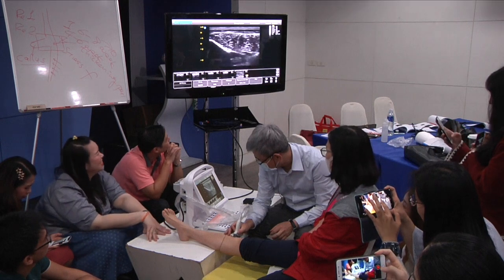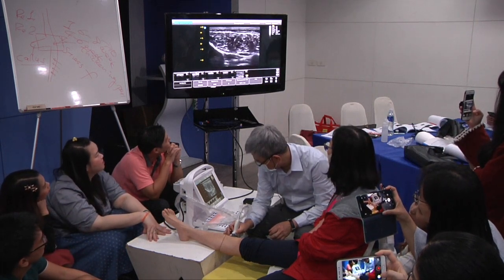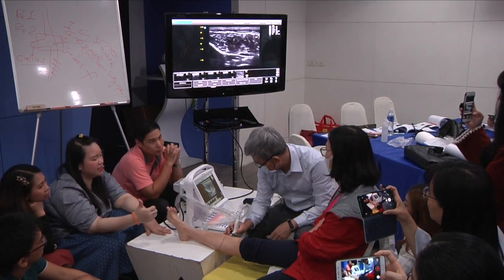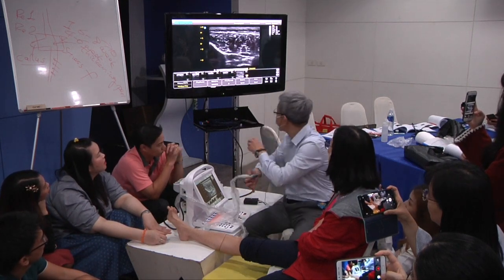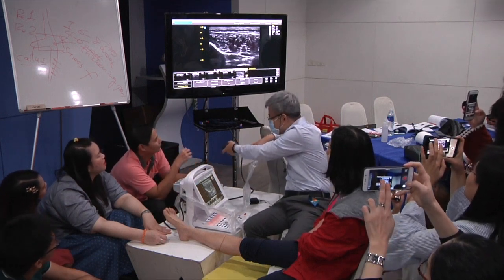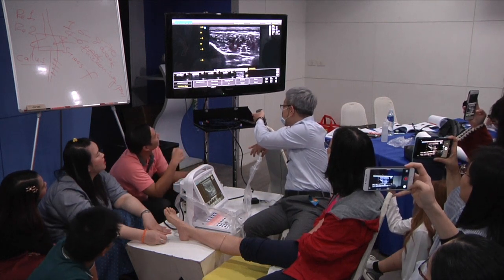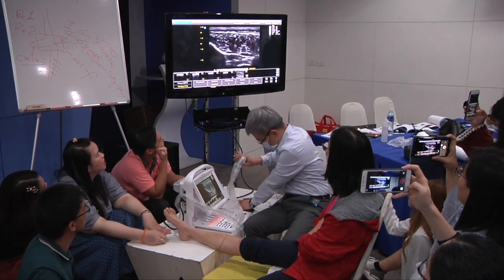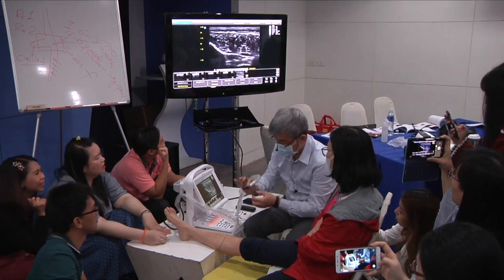Tibia anterior, go. And can you extend your big toes a little bit? Yeah, it's here. The head. Yes, thank you. The head of the extensor hallucis longus here. A little bit. This is the extensor digitorum longus. Okay?